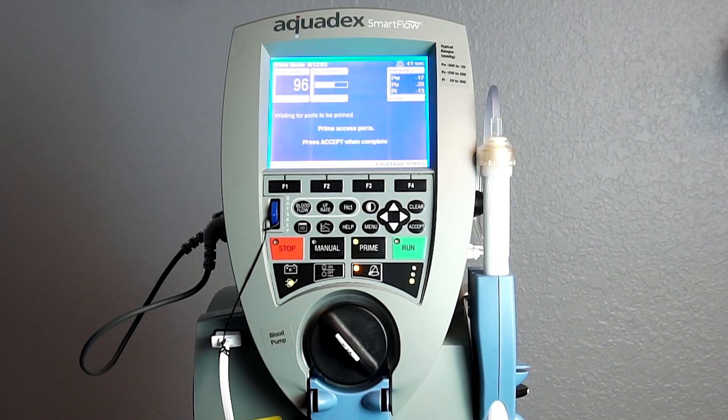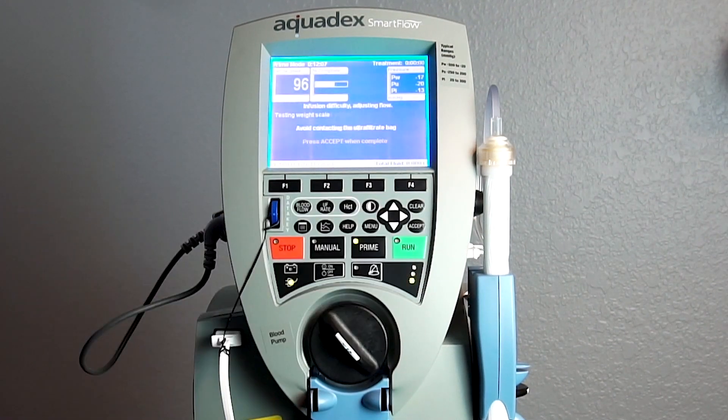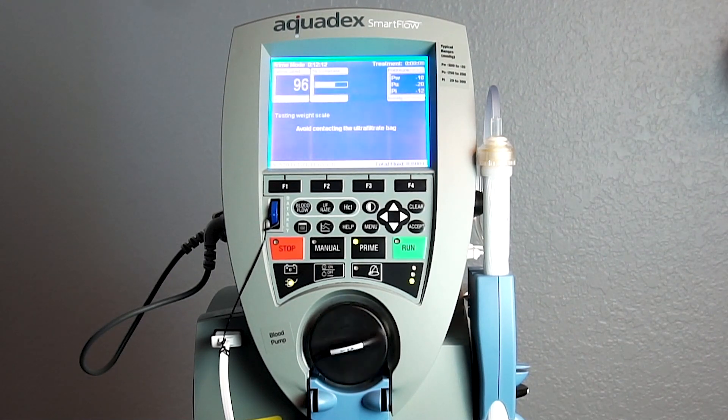Press accept when complete. The blood pump will again start to rotate.